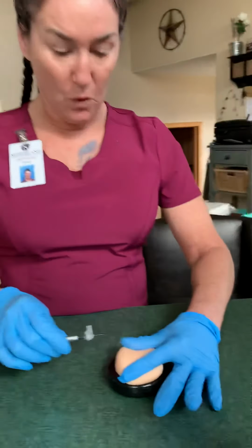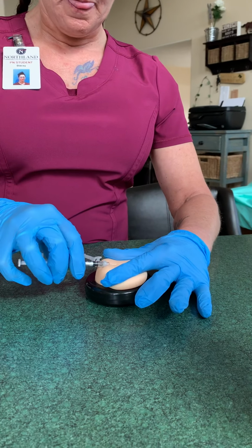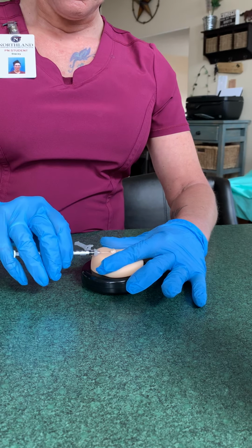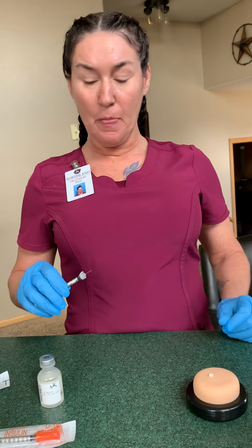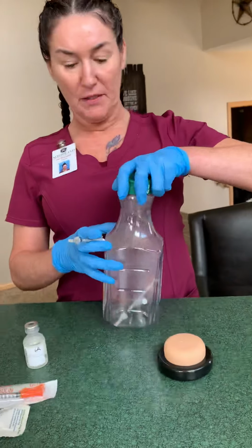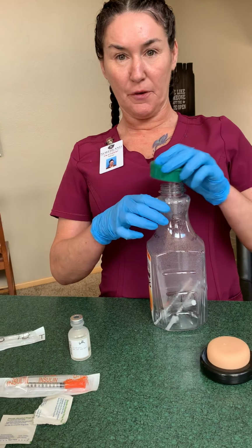For this test, we want to hold the skin taut and go just underneath the surface layer. And we will have administered our shot. Safety cap on our needles, and then we always want to dispense them in a sharp safety container.